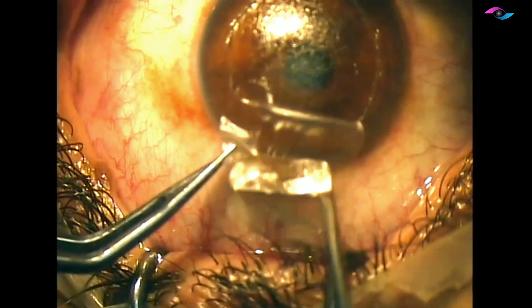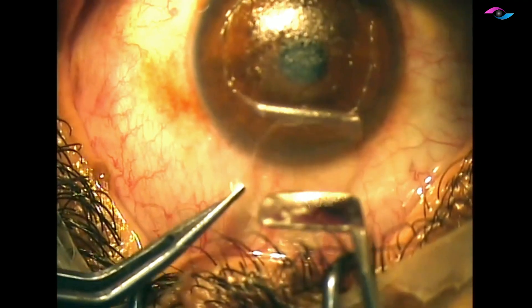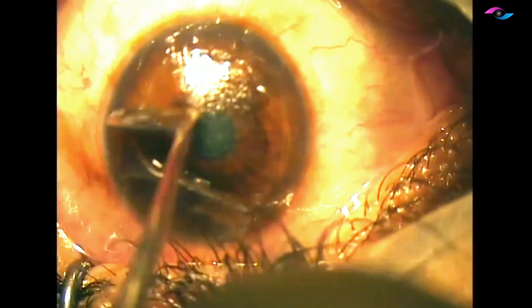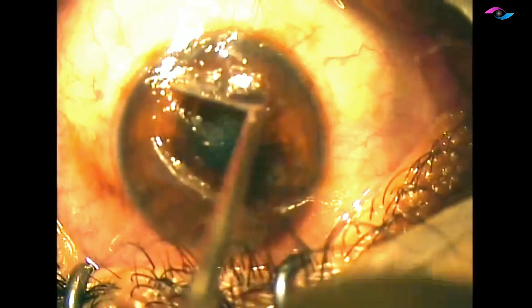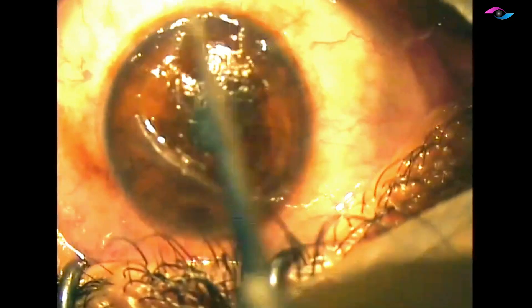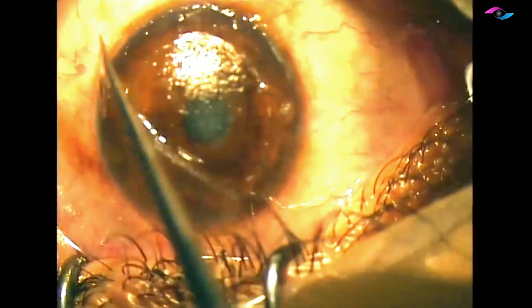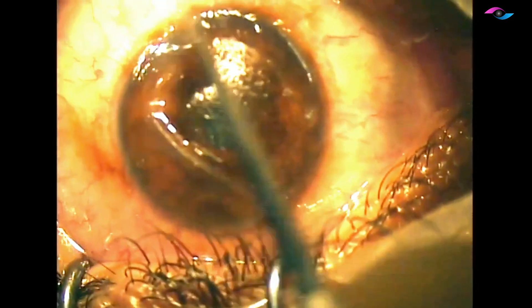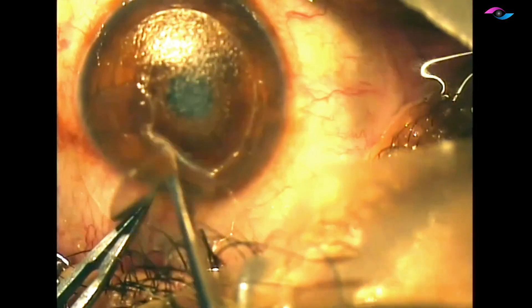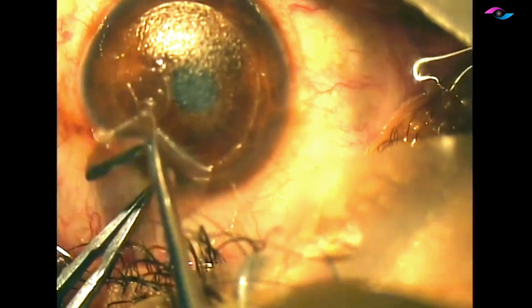We need to clean this up very nicely. After cleaning up the epithelial cells, it is also important to remove the surrounding healthy epithelium so we do not have seeding of these epithelial cells again. This is something which can help in preventing recurrences. I'm going ahead and removing the surrounding epithelium, making sure our flap is nice and clean with no epithelial seeding.